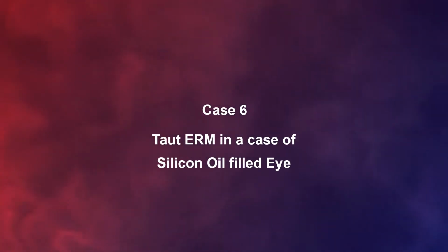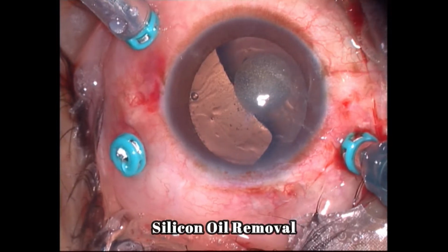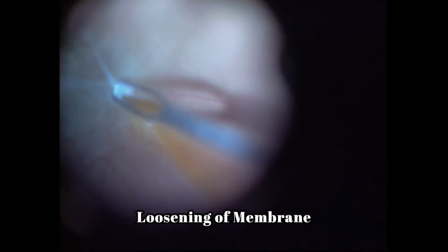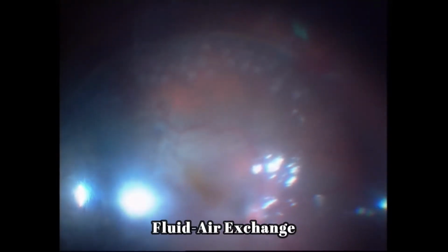In the sixth case, 25 gauge cannulae were inserted and silicone oil was removed. The membranes were loosened with the help of forceps, followed by segmentation of the thick membranes with the cutter. The epiretinal membrane was peeled, followed by cannula removal and suturing after fluid air exchange.